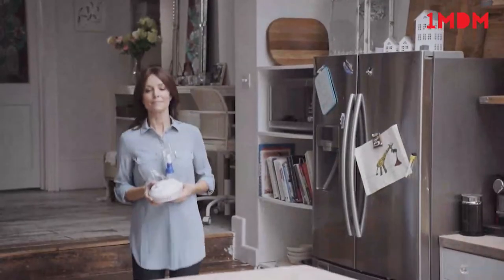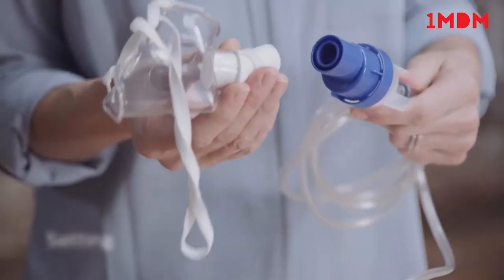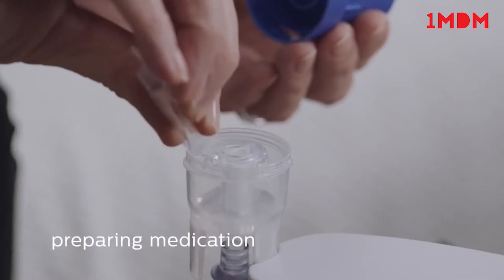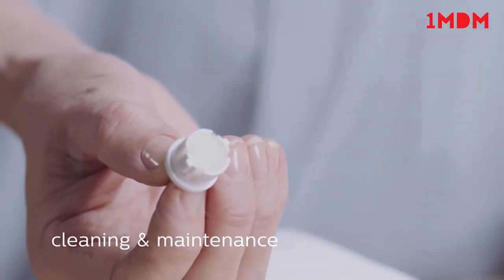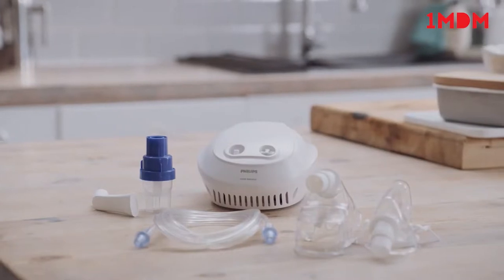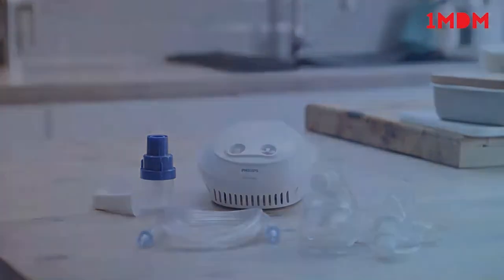This video shows the different steps to using the Philips Home Nebuliser compressor, including setting up the Sidestream Nebuliser, preparing the medication, taking a treatment, cleaning and maintenance of the product, checking and replacing the filter, as well as storage between uses. It's important to carefully read the instructions for use before you use the Philips Home Nebuliser for the first time.